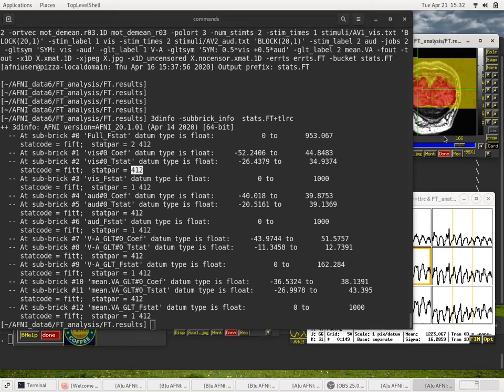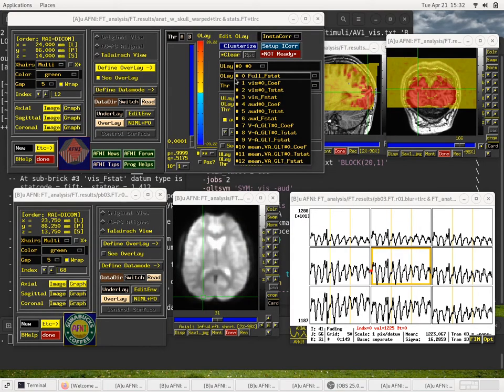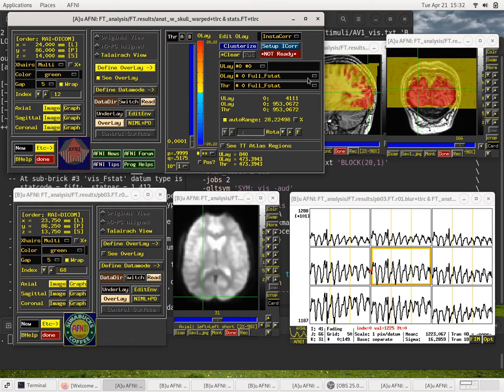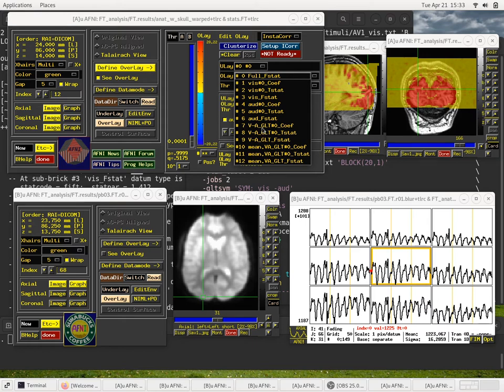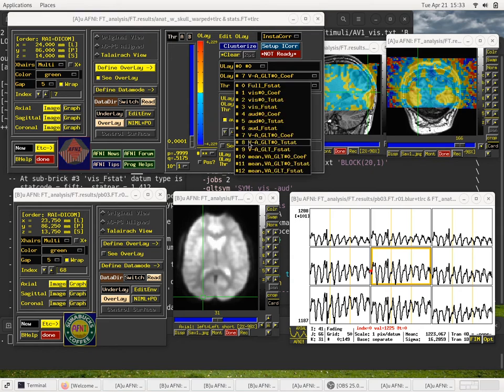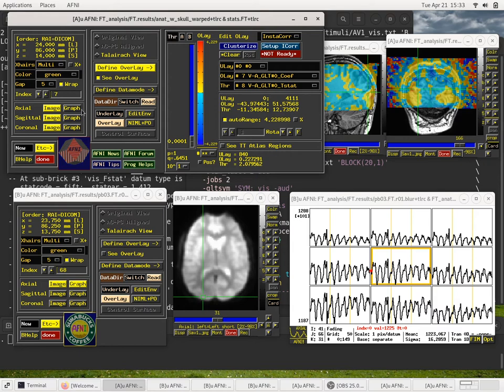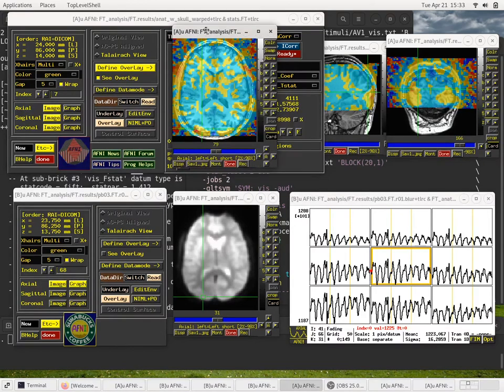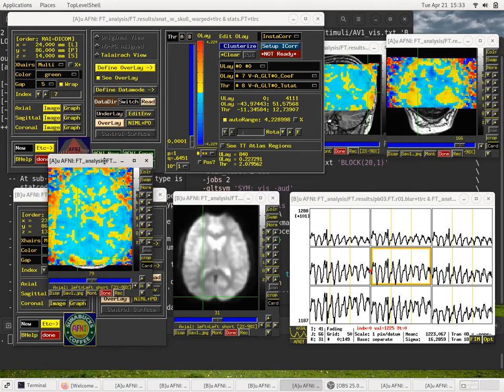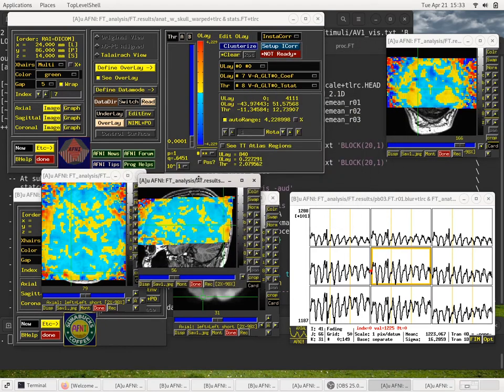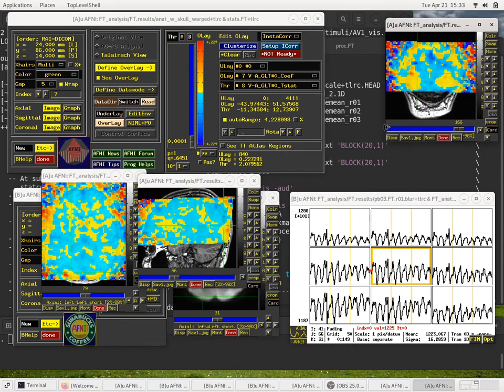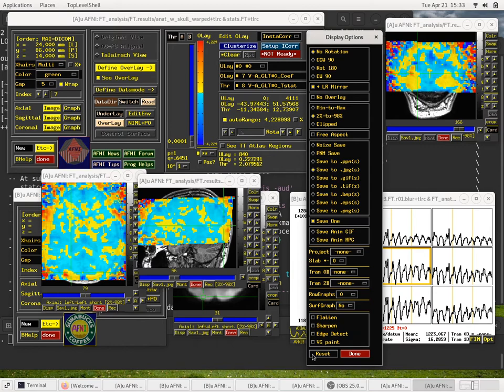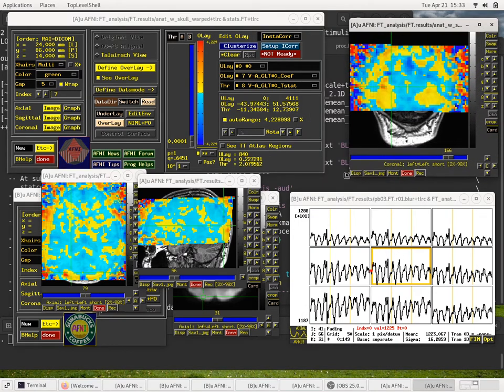So let's go back and look at something useful. Let's actually focus on first the contrast, visual minus auditory. I will start by looking, setting the Olay volume to be 7 and the threshold volume to be 8. So we can threshold on the T-stat and we'll do the coloring based on the beta weight. I think maybe I've got the opacity pretty low. I'll make the opacity higher so the color is more clear.